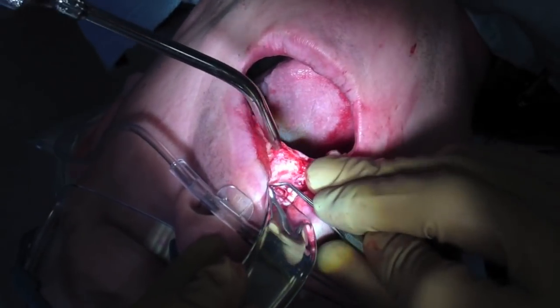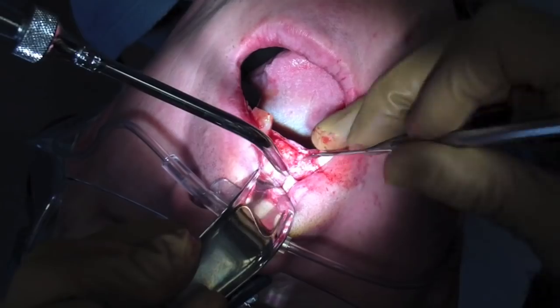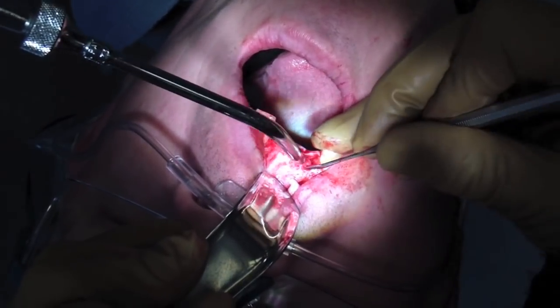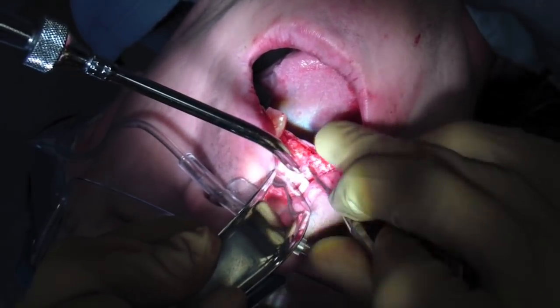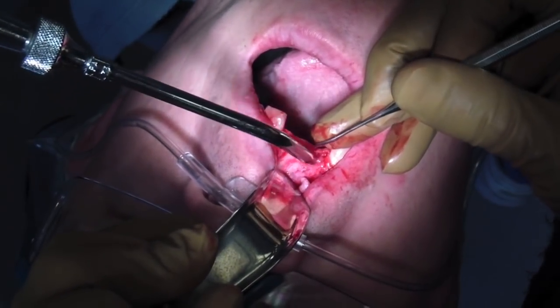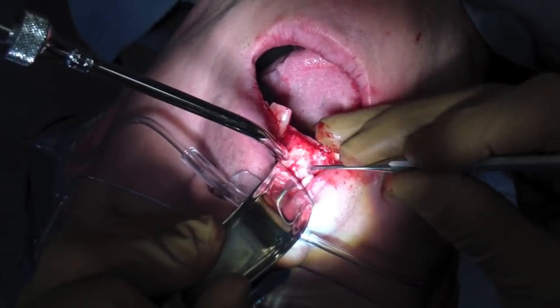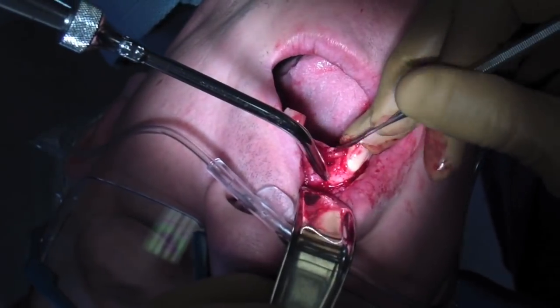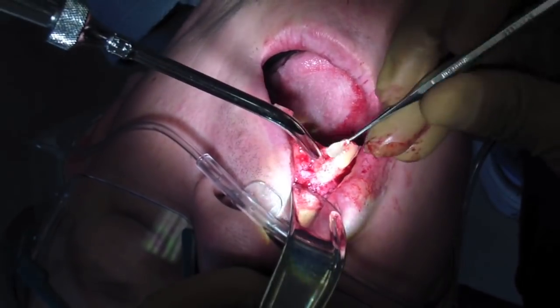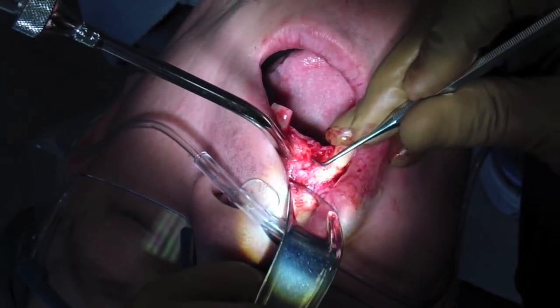So I'm just pushing, cleaning up the site, pushing periosteum away. Right now I'm going to be degranulating the socket. We're going to be placing some xenograft bovine — and if you don't know what bovine is, you typically get milk from those animals. We're going to be cleaning it up and then placing that xenograft into that socket.